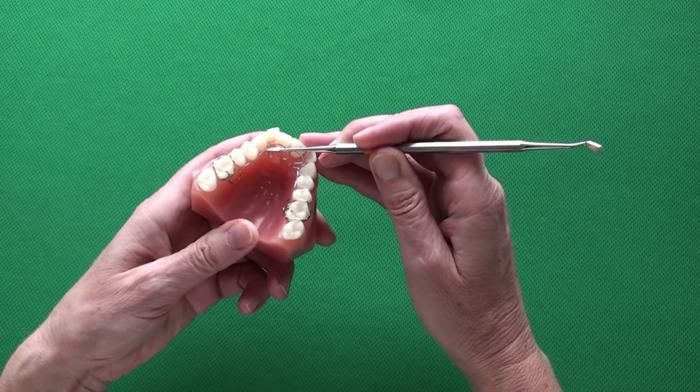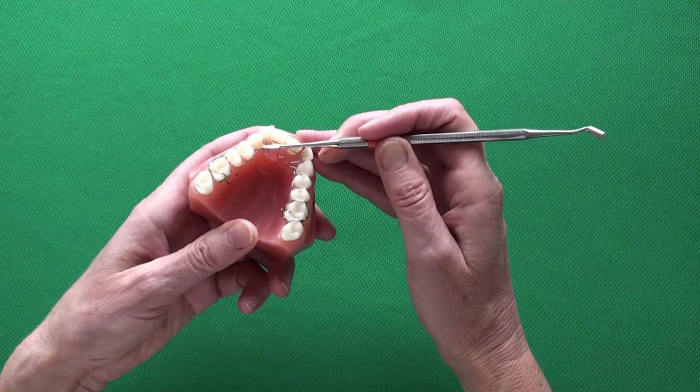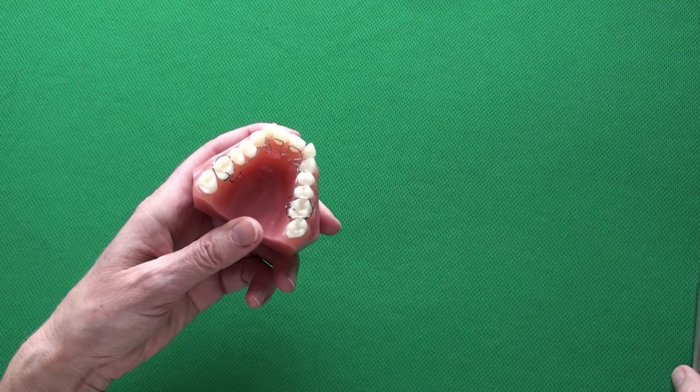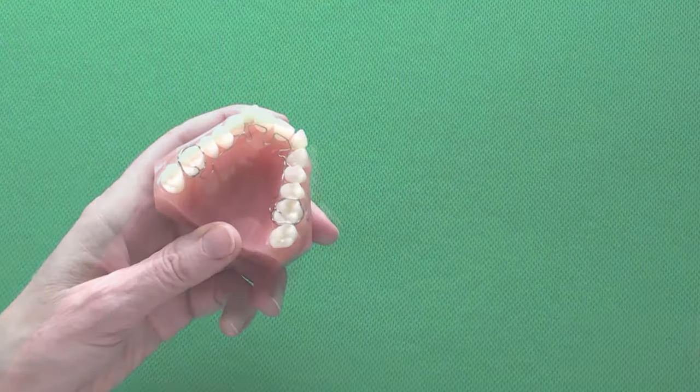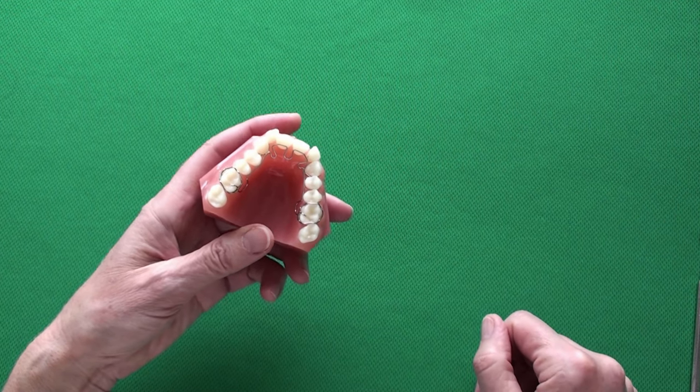If not, use an instrument. Stabilize it against the canine and pull the wire lingual and apical until it snaps in place. If needed, do this on both sides.